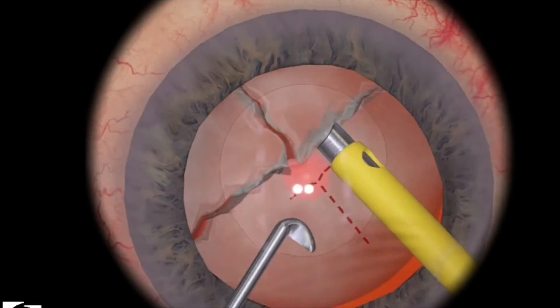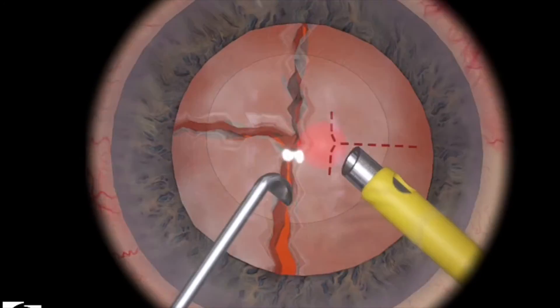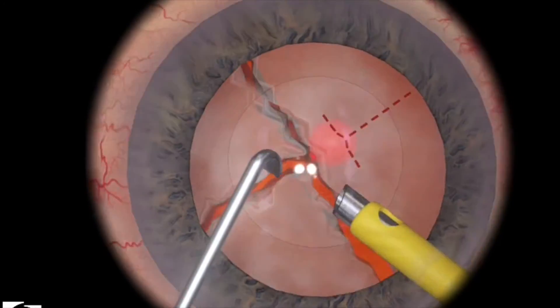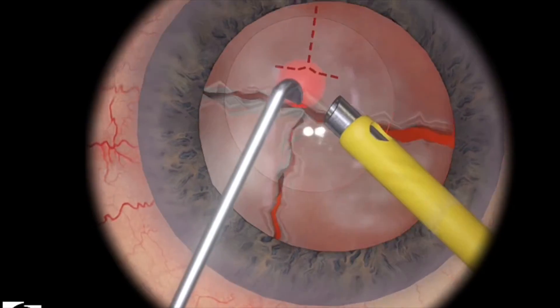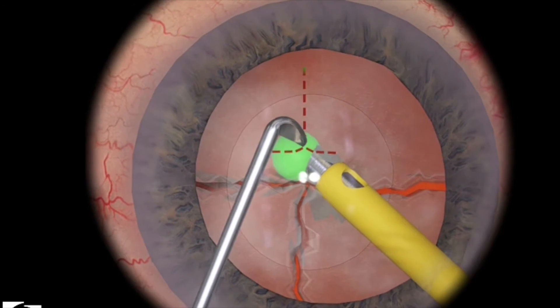I always have a little bit of a hard time with the simulator in terms of spinning the lens pieces. I find that there's sometimes a glitch, and the quadrant would just kind of fall out of place. So you want to try to be gentle.